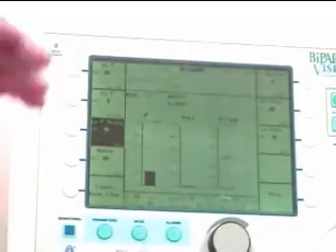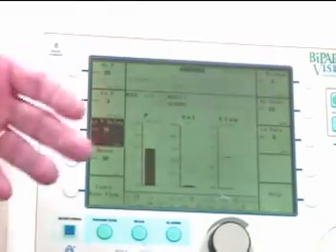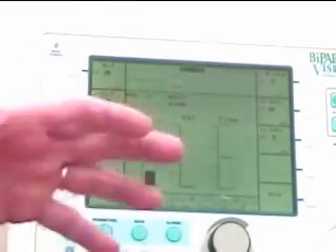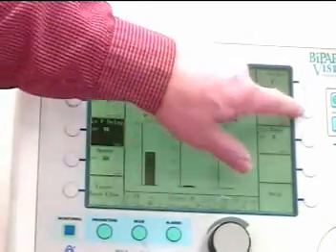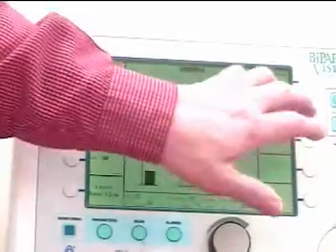High respiratory rate can be based on what you set the ventilator on or what the patient is doing. I usually take a point between the two and we'll leave it at a respiratory rate of 20.